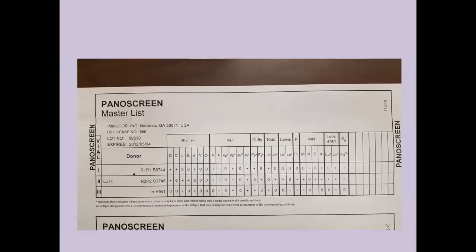Okay, and here's another one. So would the patient have reacted? Remember, anti-E and anti-N, would they have reacted with screening cell 1? There's no big E, but there is N, so yes, they would have reacted there. The anti-N would have reacted. Screening cell 2 has big E, but no big N, so chances are with screening cell 2 we would have seen only those warm reactions at AHG.